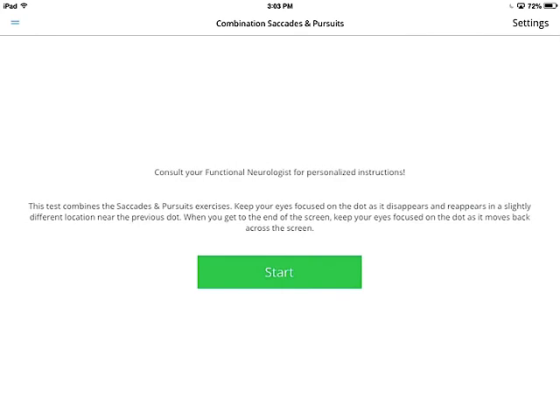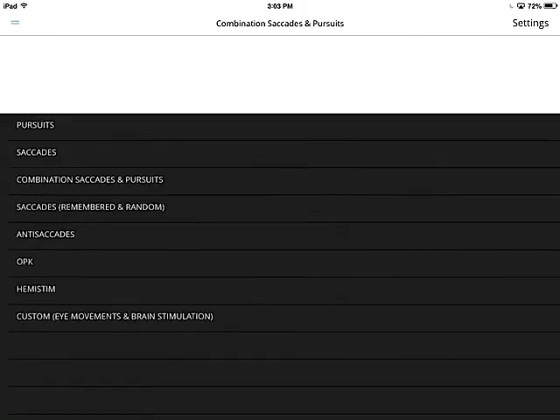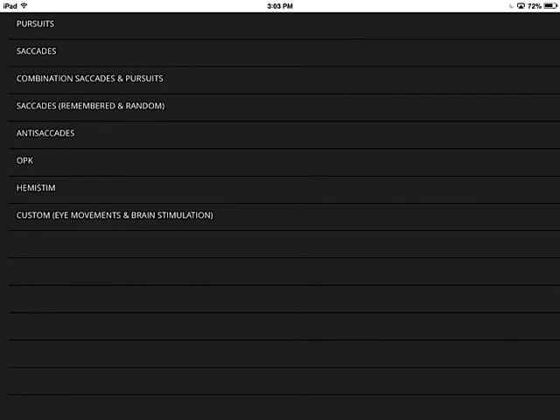And here we go — the combination saccades and pursuits in action. This is how you use the combination saccades and pursuits within the new Focus Builder, along with the pursuits and the saccades. I hope this was helpful to you.